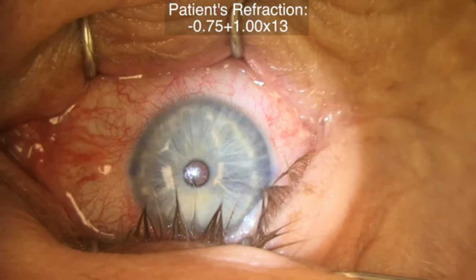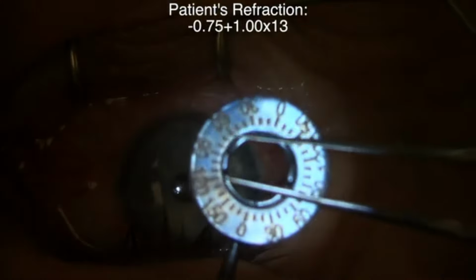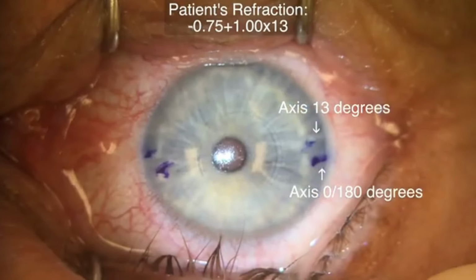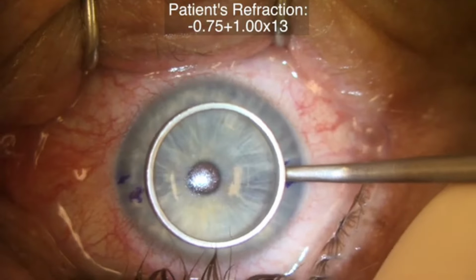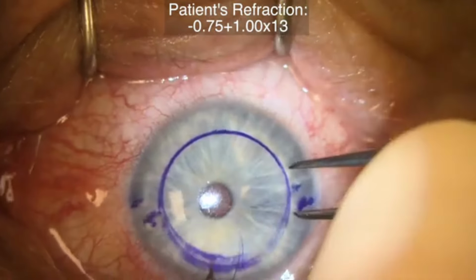It has a refraction of minus 0.75 plus 1 at 13. We mark the cornea with an 8mm optical zone marker painted with gentian violet ink. Then we mark the steep axis of astigmatism with an axis marker. Finally, we mark the length of the incisions straddling the steep axis. In this case, 1 diopter flattening is desired. We set our calipers to 2mm and then place the mark straddling the steep axis.